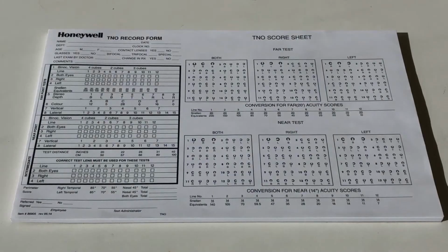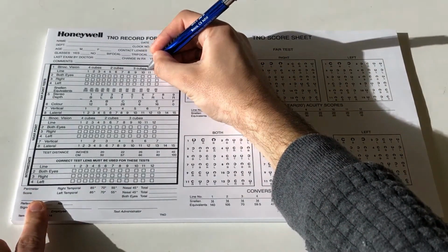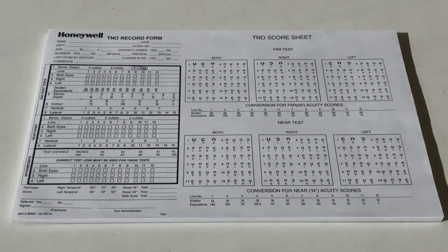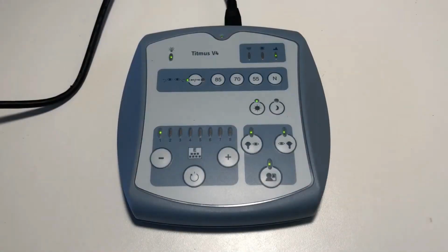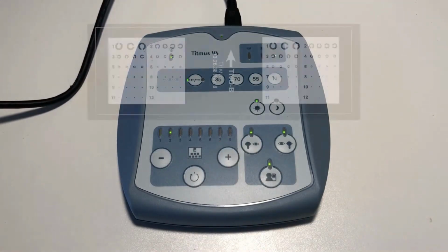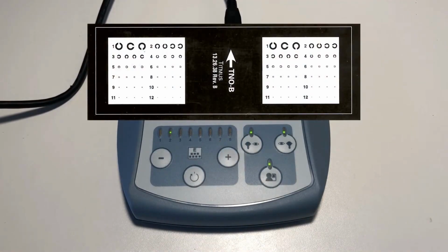On the record form, mark the number of cubes seen by the patient in the first section of the far point test box. Advance the slide to number 2 by pressing the plus sign on the control panel. This slide tests for visual acuity in both eyes.